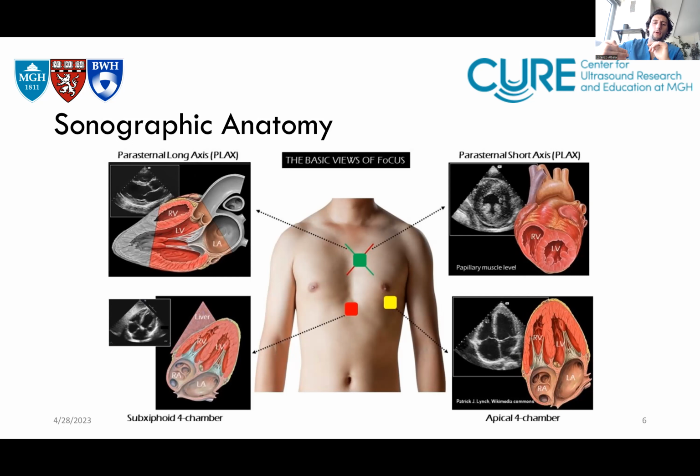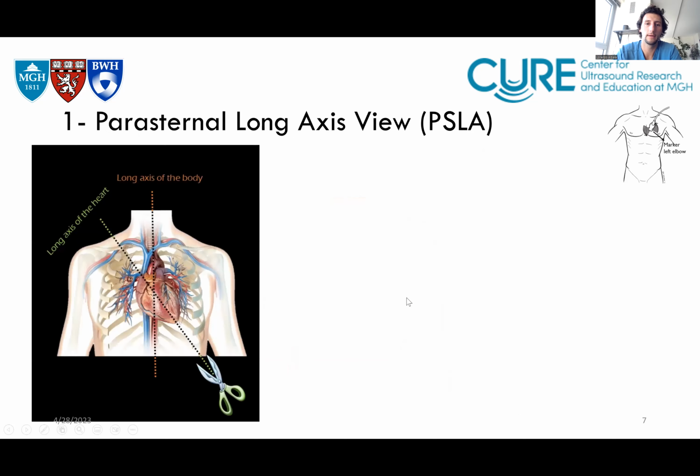And then you drag your probe towards the xiphoid area, like the midline, and point up into the chest to look at the heart through the liver as an acoustic window. So have no fear, we're going to get into each one of them right now.